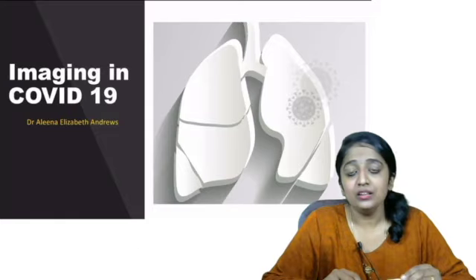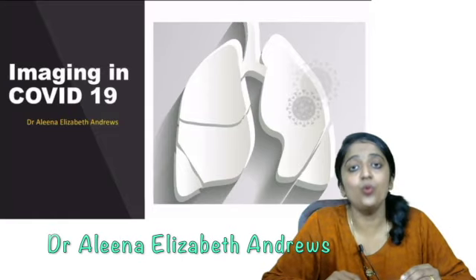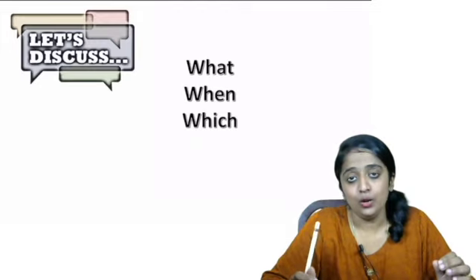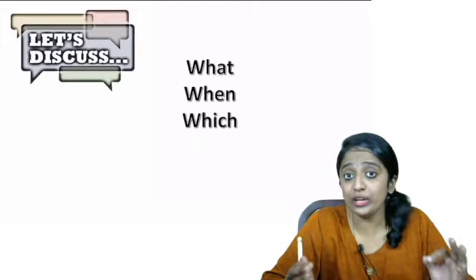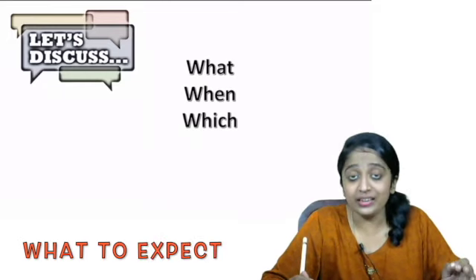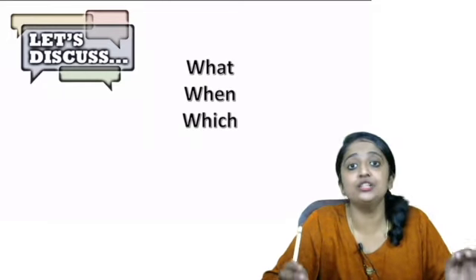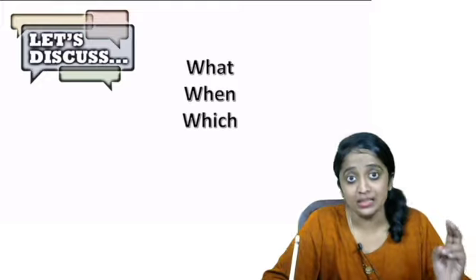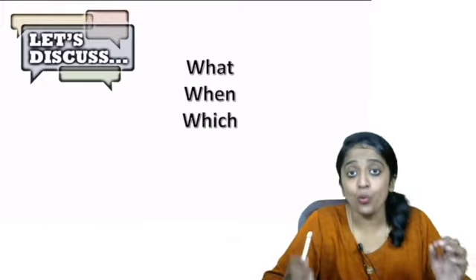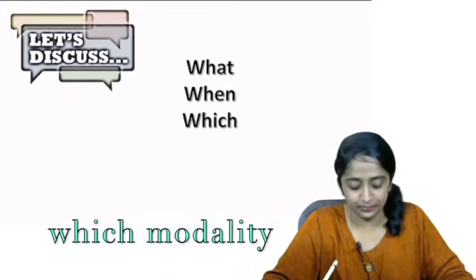Everyone. Let us discuss imaging in COVID-19. By the end of the discussion, we shall be able to answer three questions. What to expect in imaging in case of COVID-19 pertaining to pulmonary manifestation. Secondly, when to do imaging. And finally, which is the preferred modality.